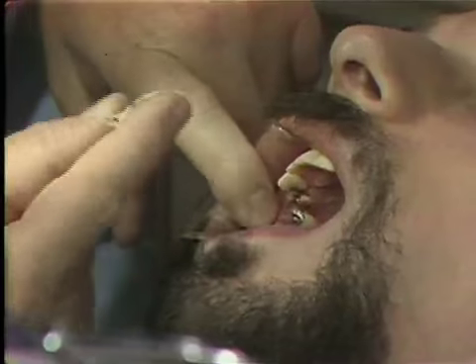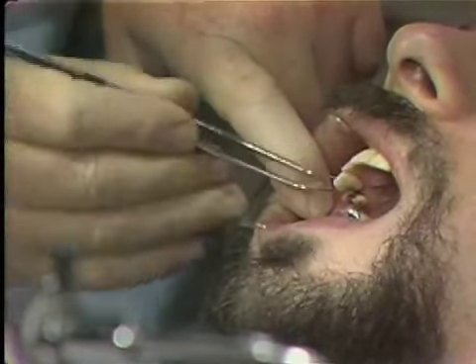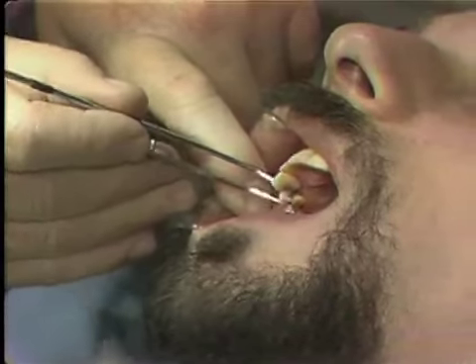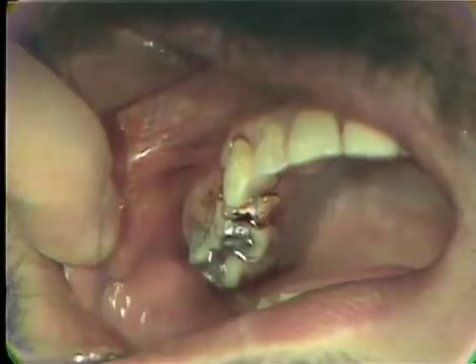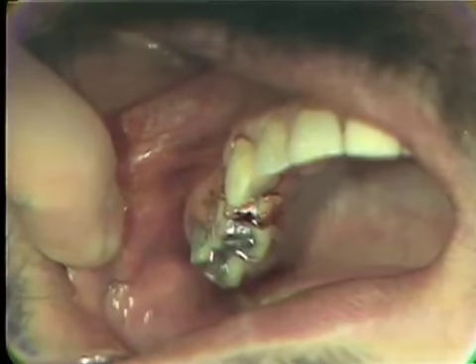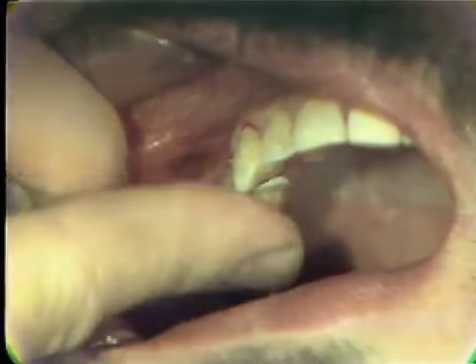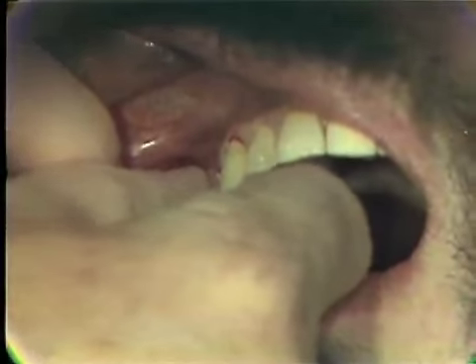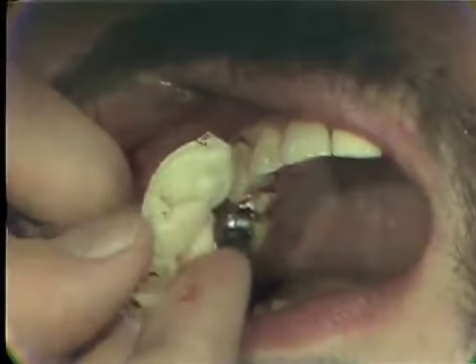Now, the portion that we added to the gingival area on the bicuspid did not stick to the original mix, and this is because we have some hemorrhage in this area. We're trying to make a temporary in the presence of a little hemorrhage, and this is not too desirable. But then again, now I can feel the temporary getting warm, so it's in its final set. We want to have it off of the tooth as it goes into the final set.